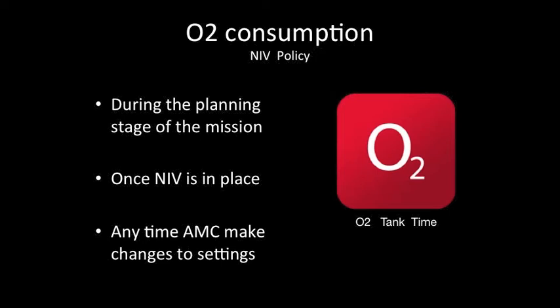It is also prudent to mention that because the Hamilton T1 is able to compensate for leak, mask seal and leak should be reassessed frequently. Mask leak must remain less than 10% at all times during the mission.